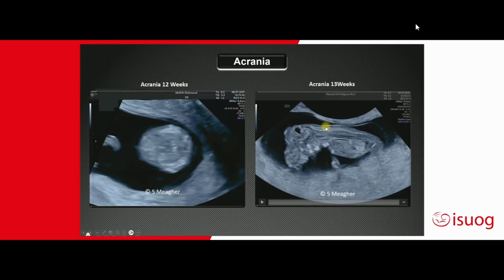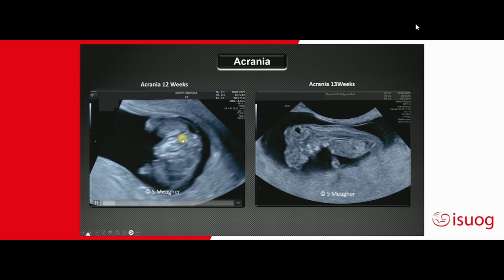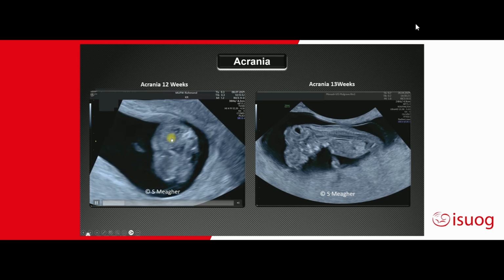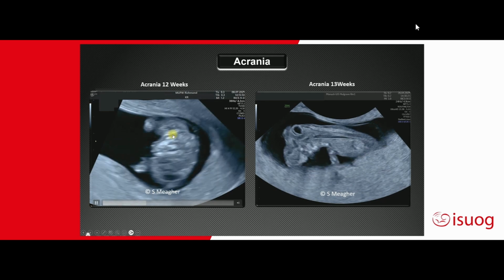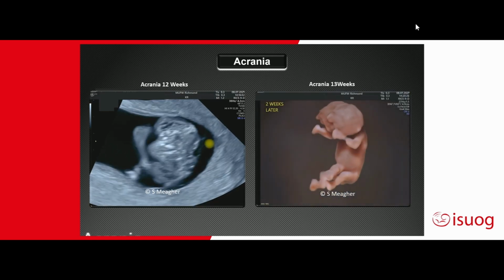When you look at this fetus, you can see a thin nuchal translucency. The untrained eye may see a normal-looking fetus, measure the crown rump length, and go home, and may not appreciate the brain is irregular in outline. However, if you go through a four-segment axial assessment, it's an impossible diagnosis to miss. None of the landmarks I've mentioned in the previous slide are evident in this fetus. This is acrania. There's no calvarium bone, no midline falx, no lateral ventricles, no choroids, no fourth ventricle. These landmarks are all absent.